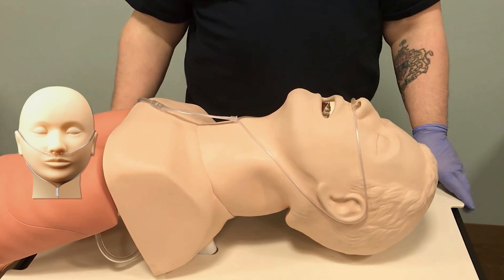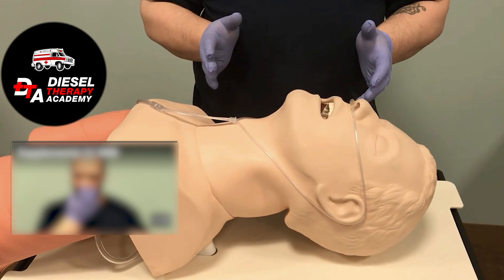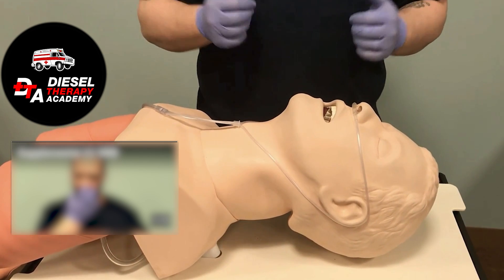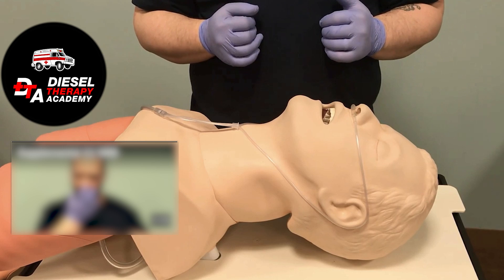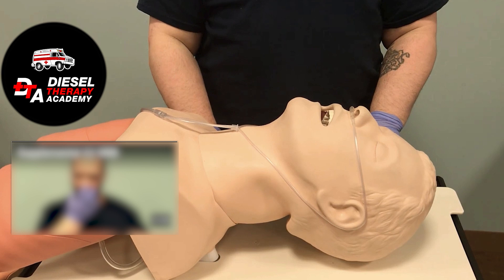This delivers anywhere from one to six liters to supplement a patient's oxygen. It's used for a patient who is breathing on their own — we're providing additional oxygen while they're ventilating adequately. It's easy to apply and you'll practice this in lab.